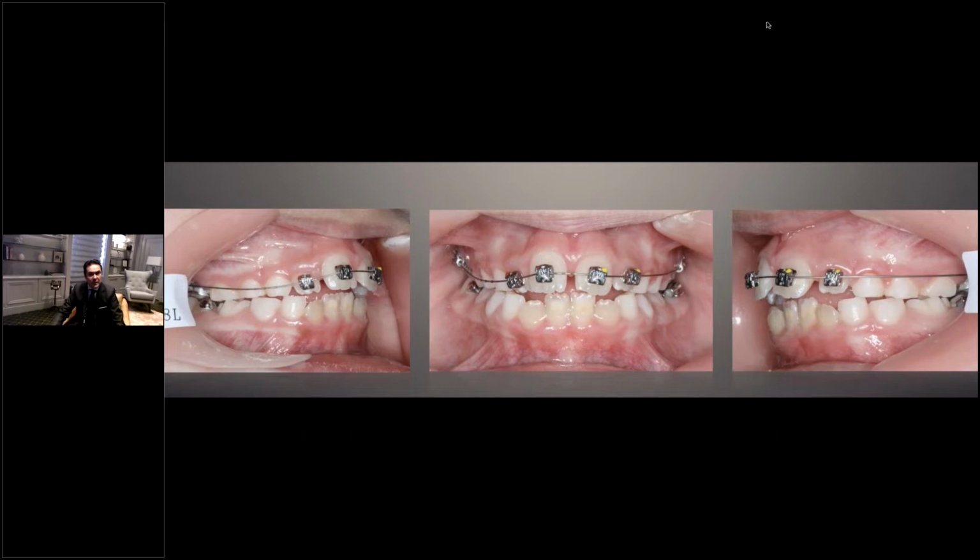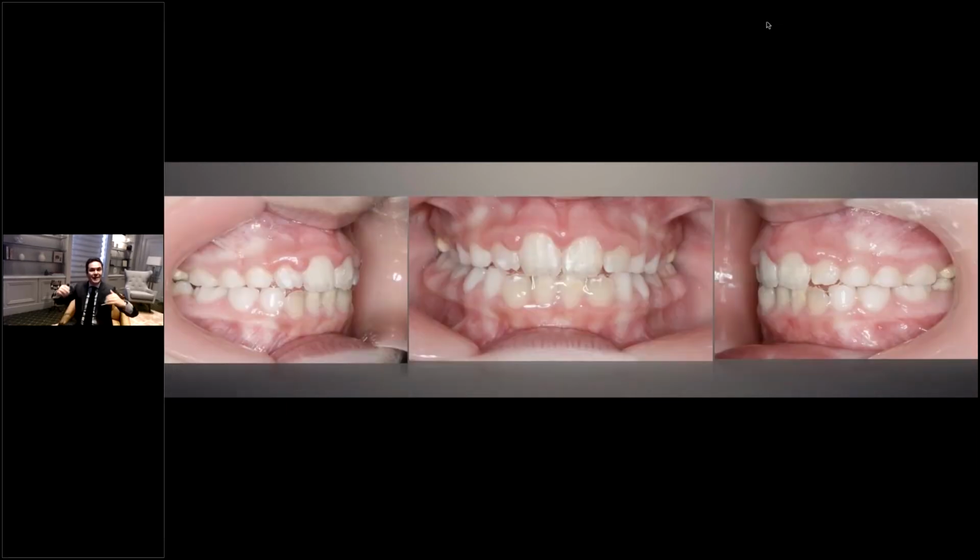Another thing that we can do, if there are some spaces in the incisors, is to just align those incisors with a round wire and close the spaces roughly, because remember this is a phase 1 treatment and this patient will probably need a phase 2 too. So we don't need to change wires here. You use a round wire and the 2x4 brackets, and the round wire is more than enough. And then we release it. We leave the case in a dentally speaking scenario in which the patient has a beautiful, correct overjet.